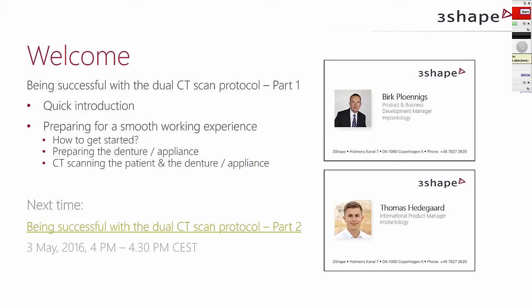So we're going to look at a little bit of an introduction to the protocol as a concept, and then we're going to talk about preparing for a smooth working experience. Then next time we have a scheduled webinar for the 3rd of May, where we will look into the software side of things and using the dual scan protocol with Implant Studio.